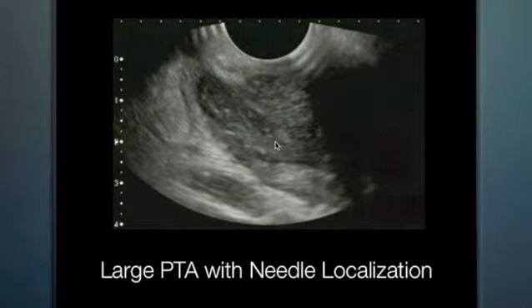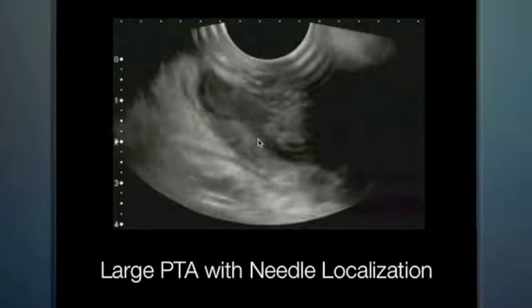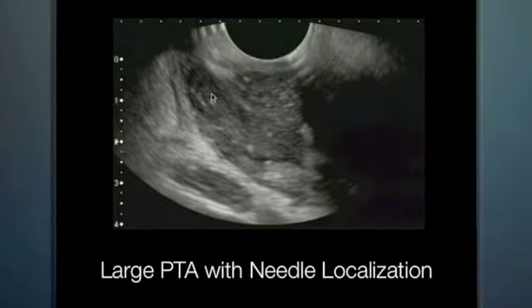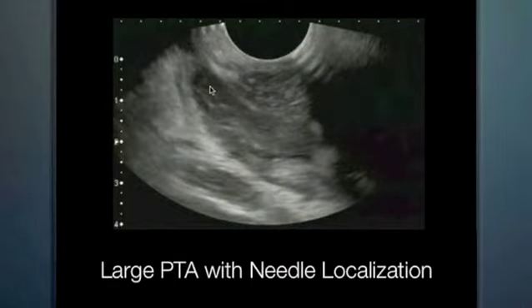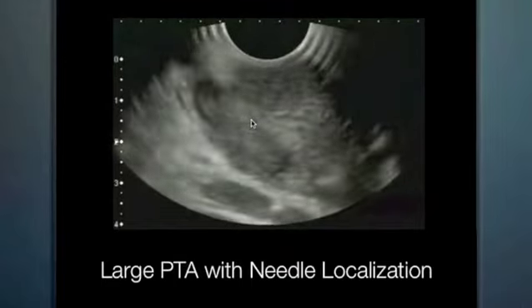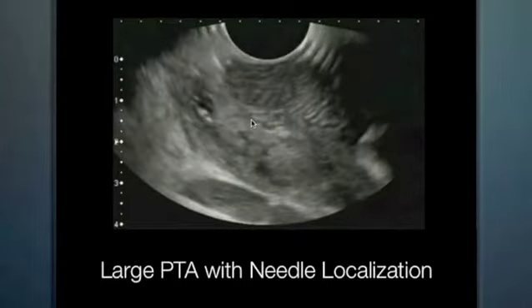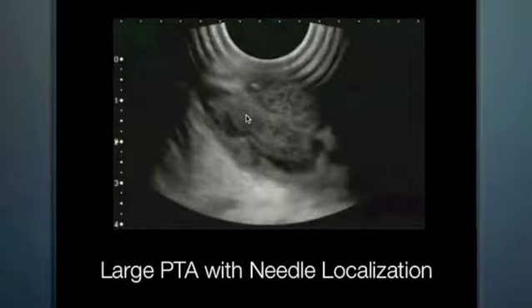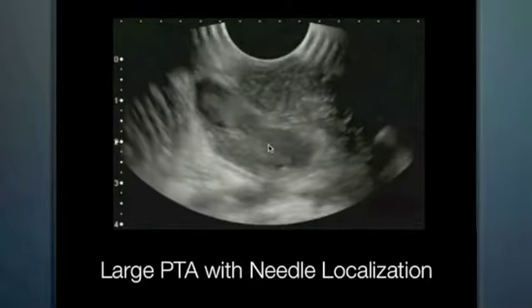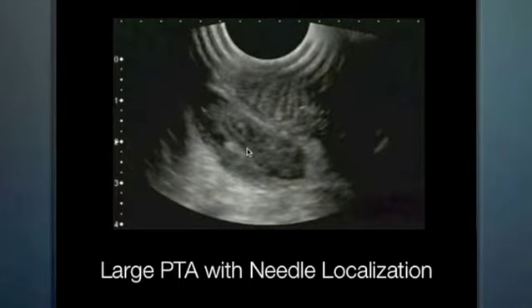and this very severe degree of a peritonsillar abscess. You may find that some of these are so large that they're very easy to drain, or that they're so extensive that they may need to be actually drained in the operating room for maximum comfort and securing of the airway. However, ultrasound does help to differentiate how difficult or easy a drainage procedure could be. And we can localize the needle.